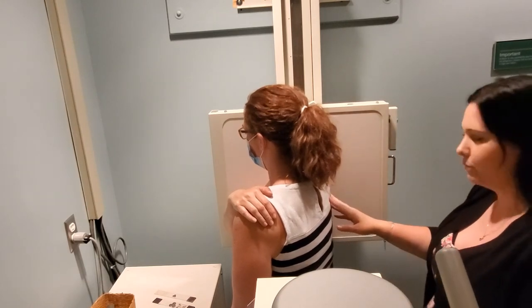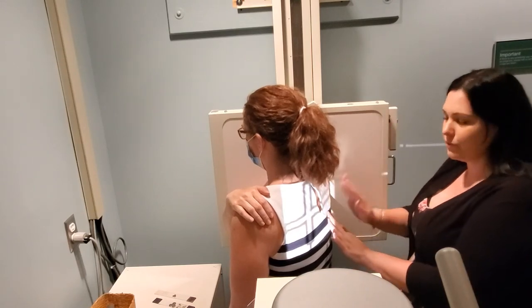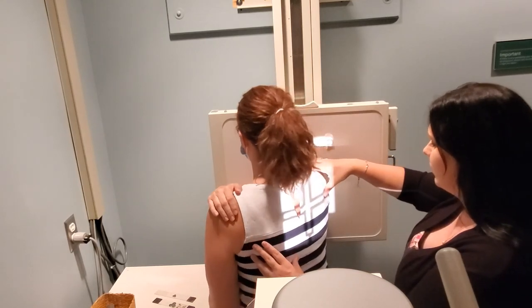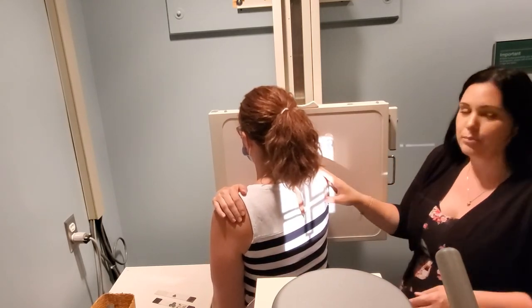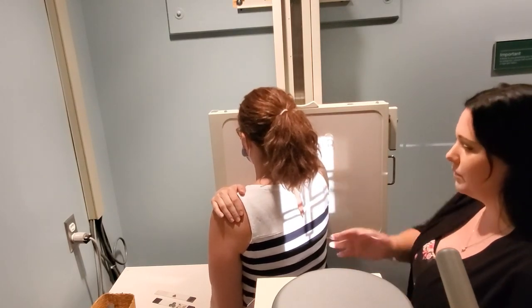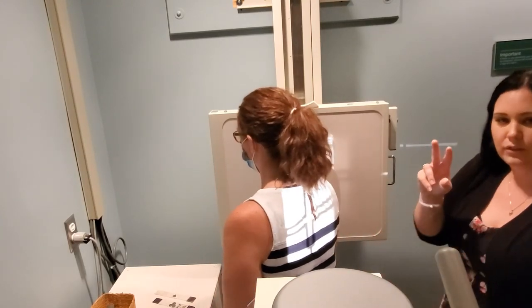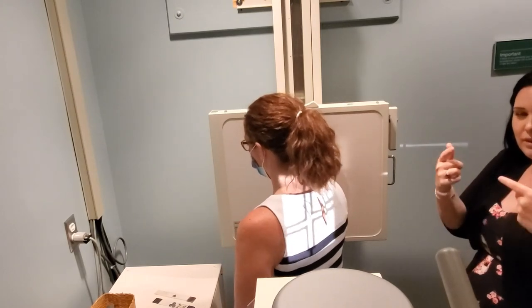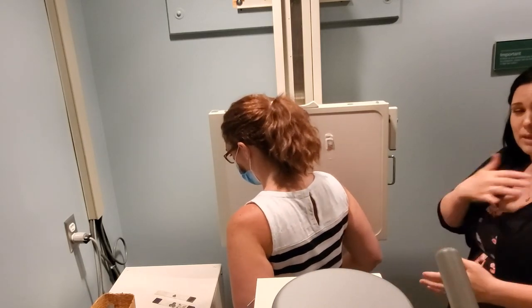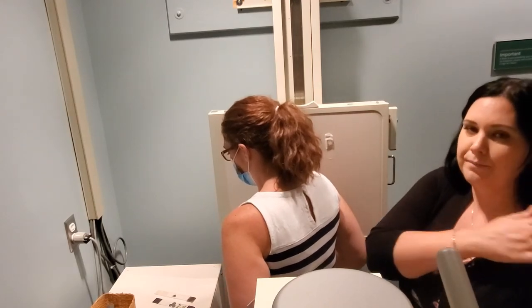This position is a little tougher because it pulls into the muscles and the rest of the body — it's really flush for most people. The rest of the projection is the same as the scapula Y. A helpful mnemonic: for the body of the scapula, arm across the body — body to body.